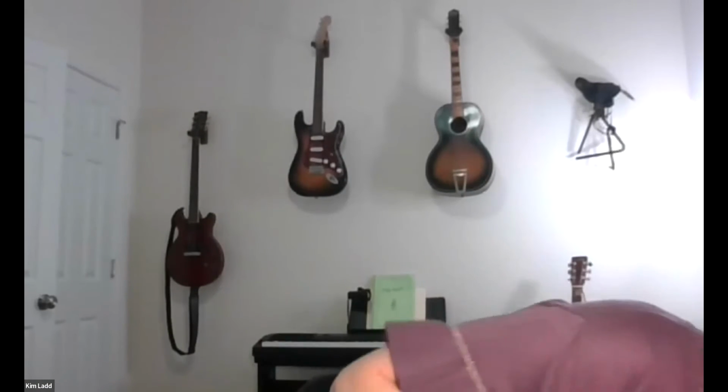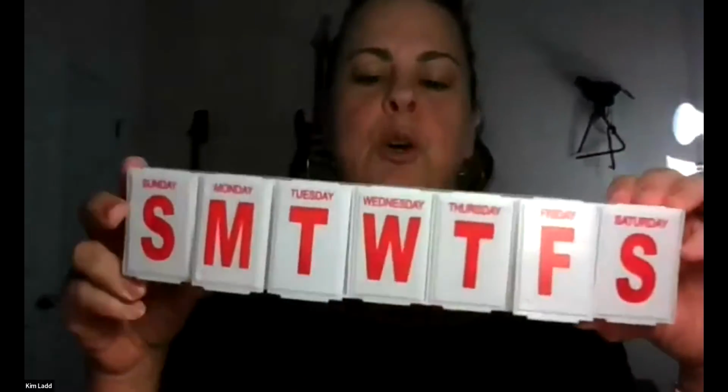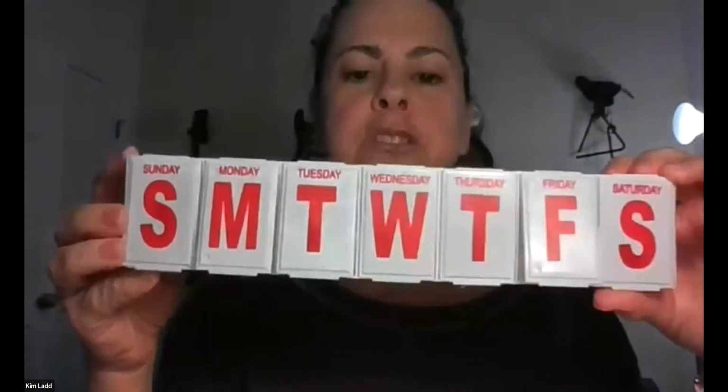All right. And then there's also pill boxes. So there are pill boxes. This is, let me find my example. So this pill box is a large print pill box. I mean, geez, I think each box is like 2 inches by 1 inch. And it has Braille dots on it for the days of the week.